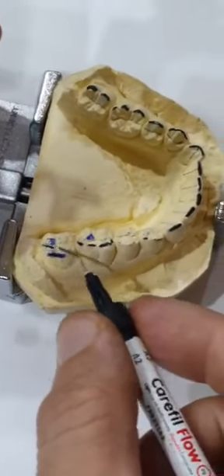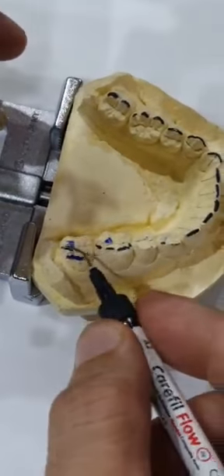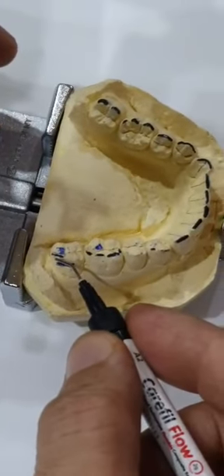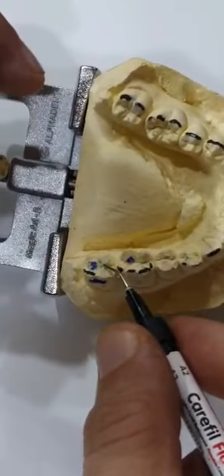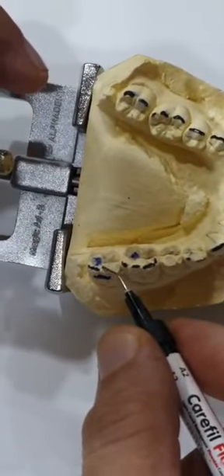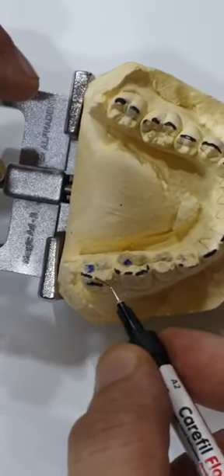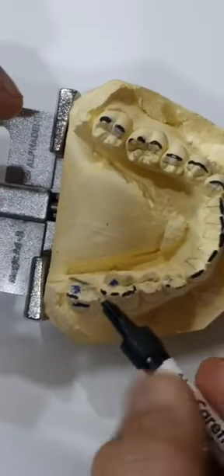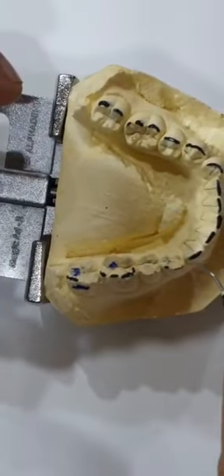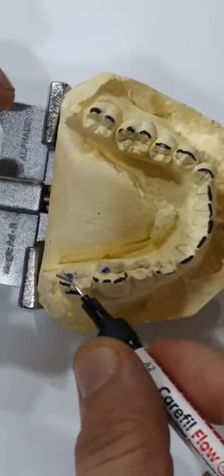What I would do is in the mouth I would etch the tooth very nicely, clean it, dry it — on the occlusion surface only, on the occlusion table — and I would apply a couple of spots of adhesive. If you are doing this for very long term, like in orthodontics or orthopedics, apply the adhesive fully. If you're doing it temporarily within a week or so and you're going to change the whole occlusion, I would not apply the adhesive except maybe one tiny spot somewhere to keep the composite there.